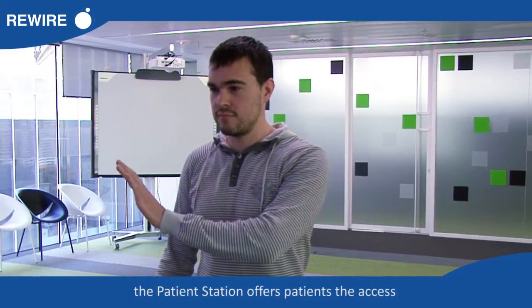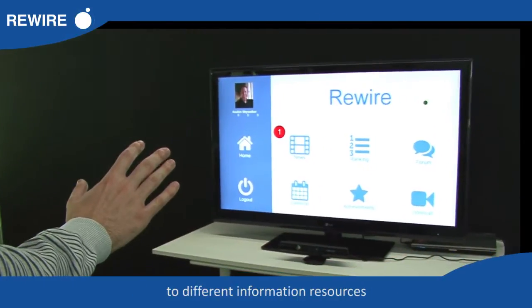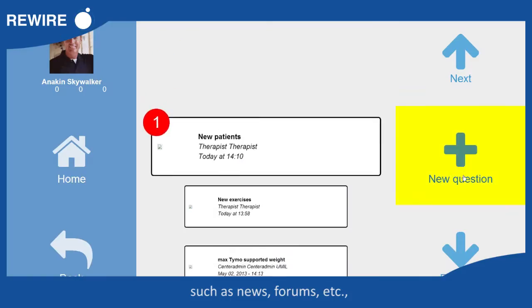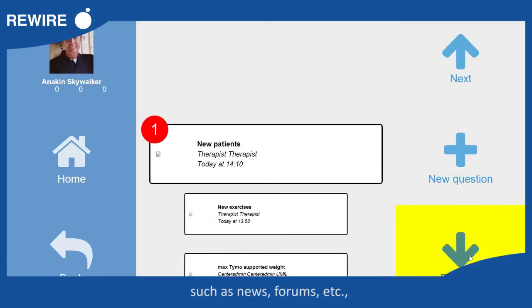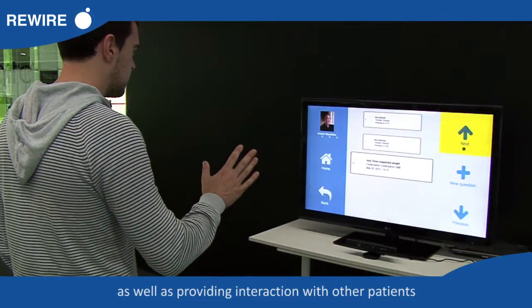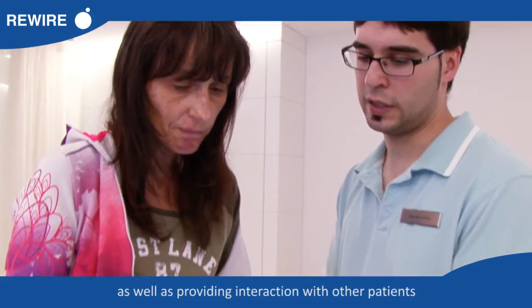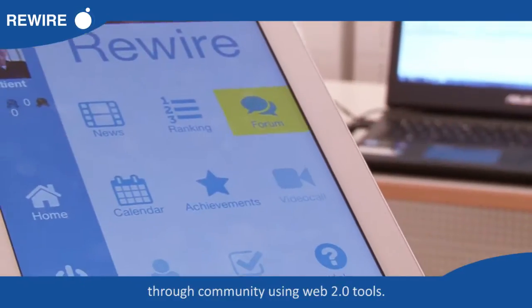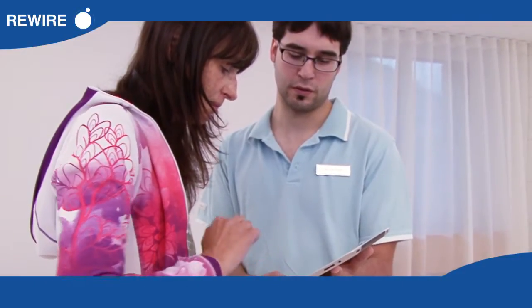In addition, the patient station offers patients access to different information resources such as news, forums, etc. about their pathology, as well as providing interaction with other patients through a community using Web 2.0 tools.